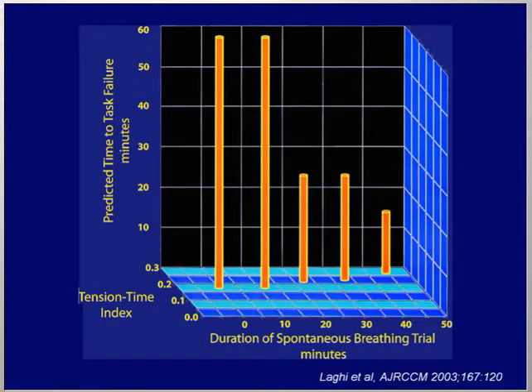So what does this mean? Well, so far we motivated the study of patient-ventilator interaction by the fact that there is increased effort, both during inspiration as well as during expiration, that can increase the oxygen consumption of these muscles and maybe injure these muscles. But then Franco Laghi's work put a spanner in that motivational line that I could use in my papers, by suggesting that when patients are breathing spontaneously, they are not even on the ventilator.